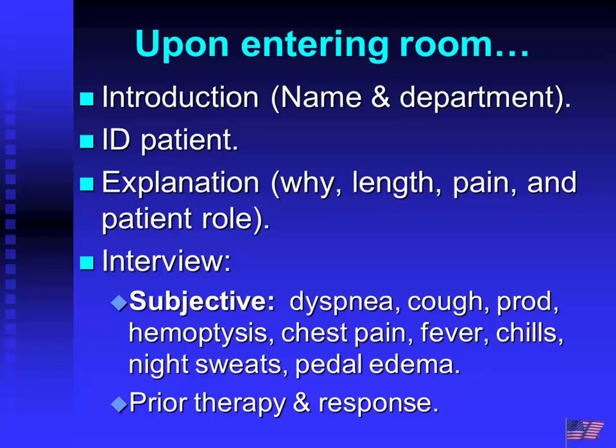Hi, I'm Rick from Respiratory Therapy. I'm here to administer a breathing treatment for you. Again, identifying the proper patient and explaining why we're there, what the length is, that it won't hurt, and what they need to do. And then looking at some other things as far as the interview, some of the subjective things, if they're expressing anything as far as dyspnea, if they have the presence of a cough, and if it is productive, any presence of hemoptysis.